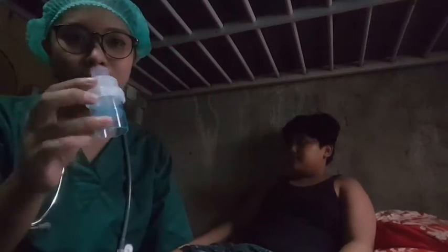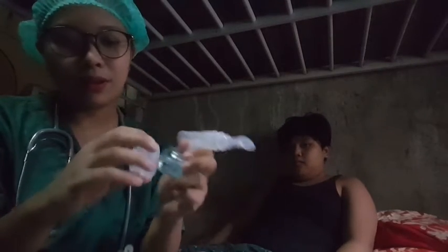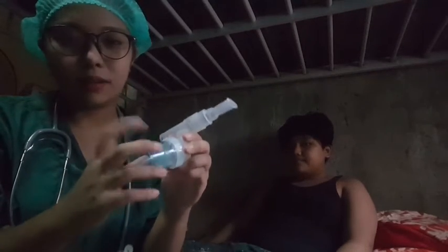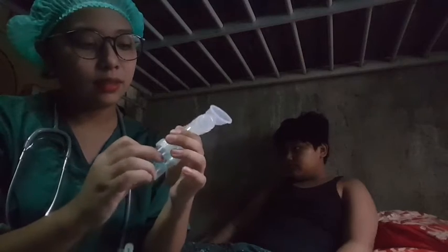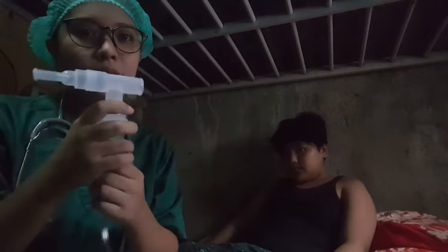Now we take the nebulization cup from the device and open it, and place the premeasured unit dose medication. So here it is, the nebulizer cup from the device, and open it for the premeasured dose. In this case we do not use any medication, but in some cases we could put it here and then set up the nebulization cup and connect it to the device.